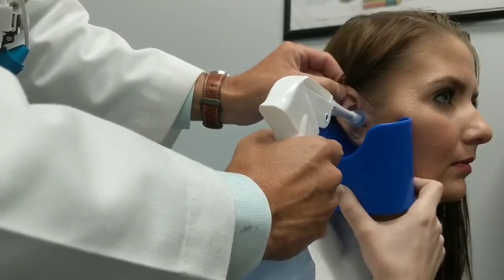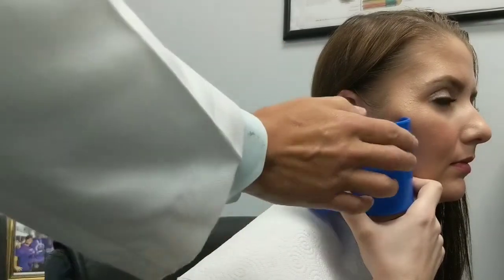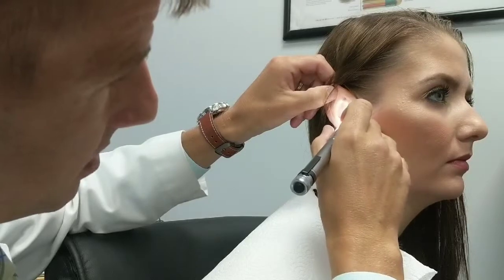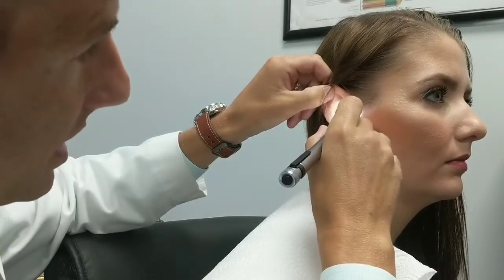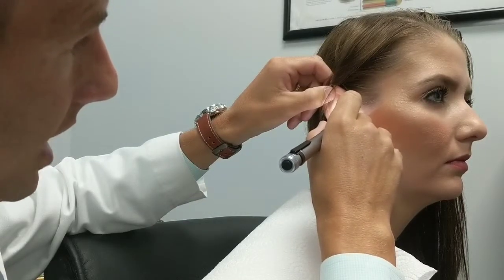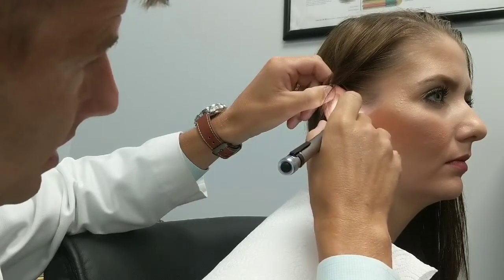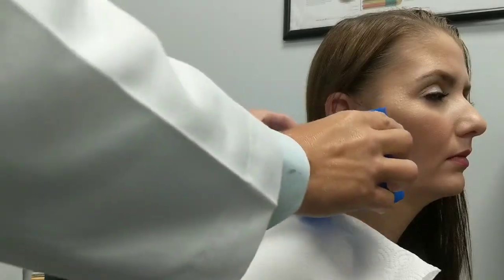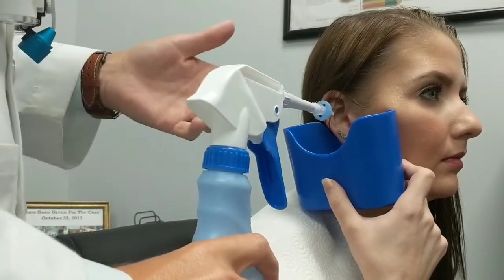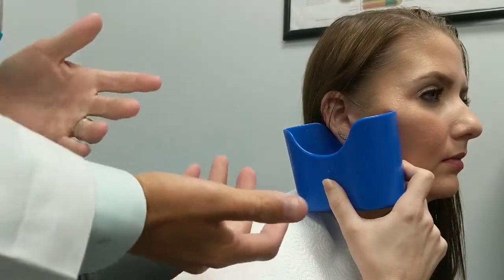If I've removed some wax but hit a wall and am now unsuccessful, I take the basin from the patient and start using my curette technique. I make sure I'm bridging and bracing and always pull on the ear, which really allows me to see well. When I remove or disrupt the wax, I make sure I'm not touching any of the sides — it's kind of like playing the childhood game Operation. Once I've either removed it or think I can get more wax out, I redo the lavage step and repeat. Using the curette cuts down time on constantly flushing the ear, so I'm not running into the ear becoming very red or having any chance of bleeding.